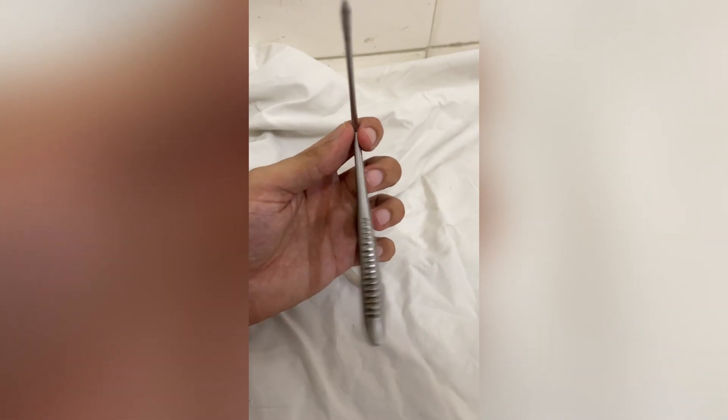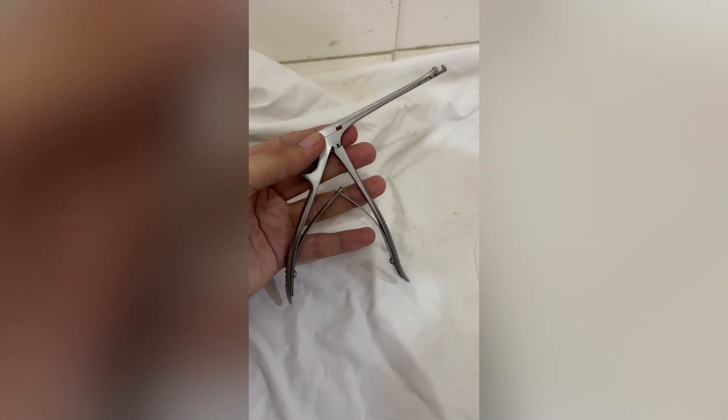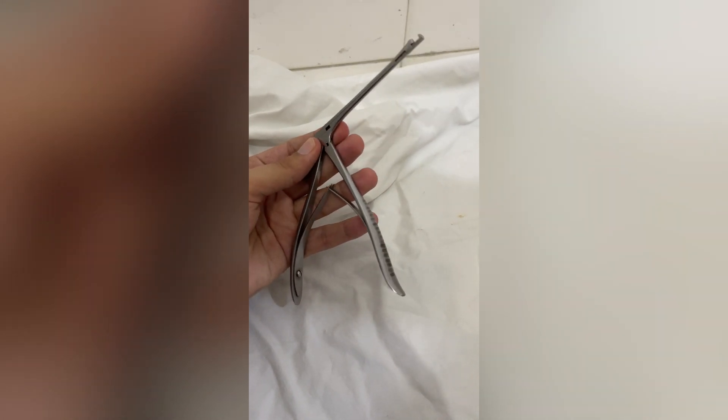This is used to remove the lacrimal fossa and the anterior lacrimal crest to expose the lateral nasal mucosa in DCR surgery. It is used to initiate the process of making ostium.